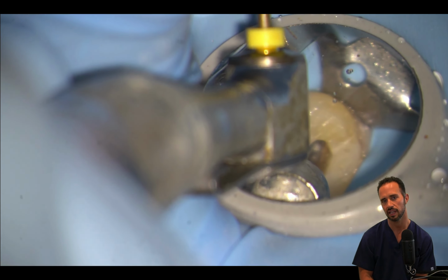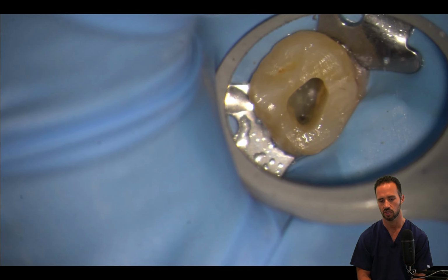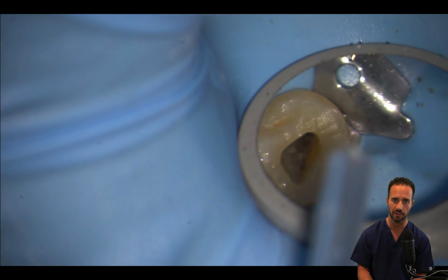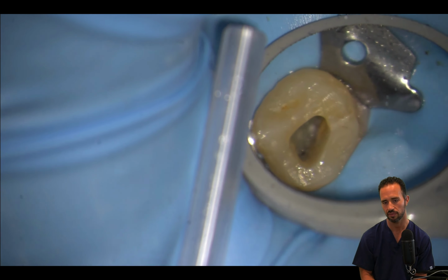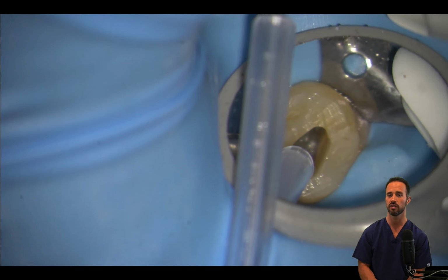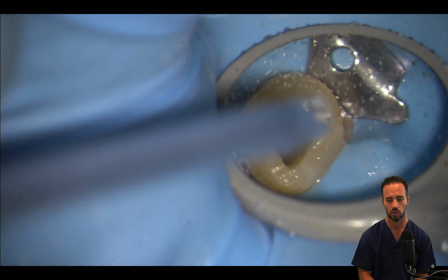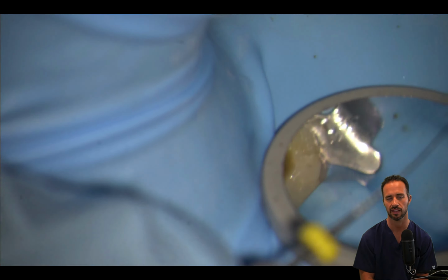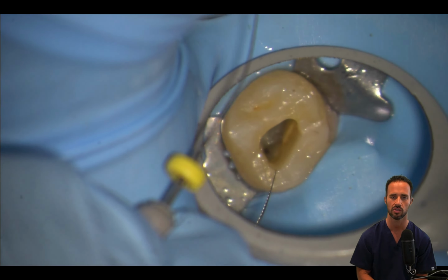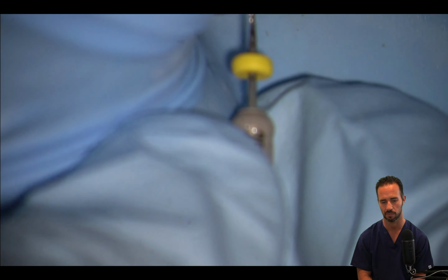And remember, there's less MB2s in upper second molars than in upper first molars. So we're not thinking that there's definitely an MB2 in this case. But you really want to give it a chance here. Also, if you're dealing with a vital case, as we are in this situation, you'll likely find a little bleeding from the region of the MB2, which is great because that tells you that you do have an MB2 there that you need to continue to search for, assuming obviously you haven't perforated the case at this point.